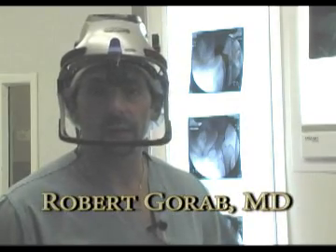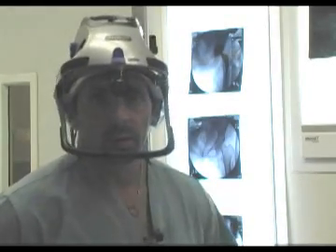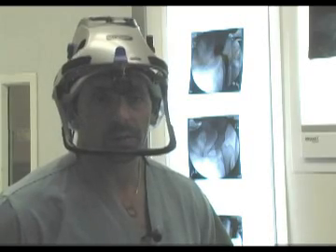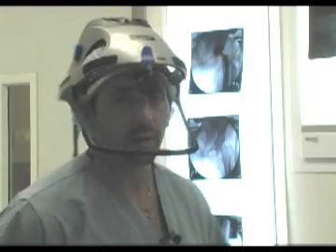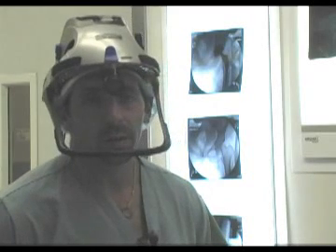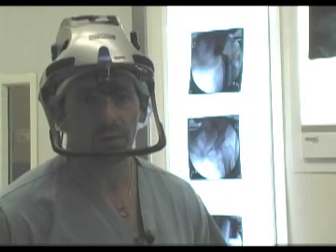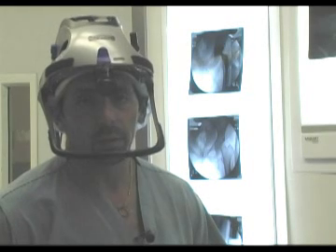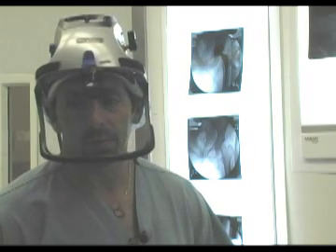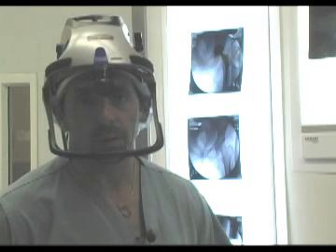This is a 60-year-old active female known to me through prior knee replacement surgery who has a relatively rapid onset of increasing hip pain, MRI documentation of severe avascular necrosis of the right hip, and has a marked disability. She's now essentially on crutches and quite limited. She's active and at this point is interested in proceeding with replacement.